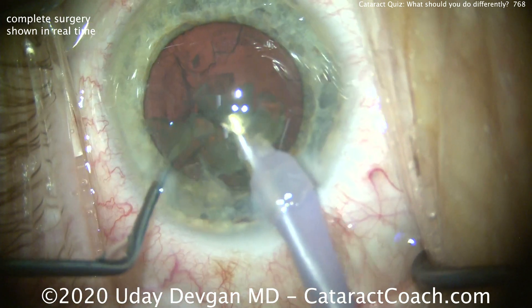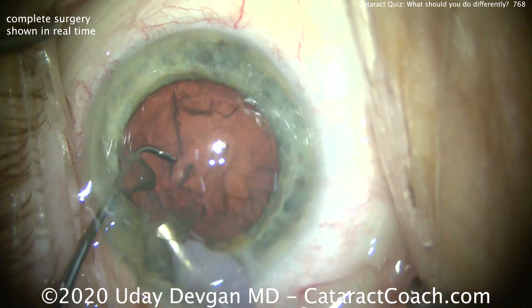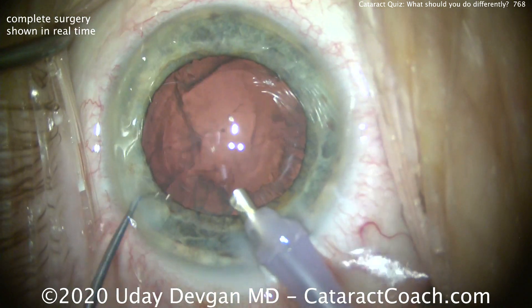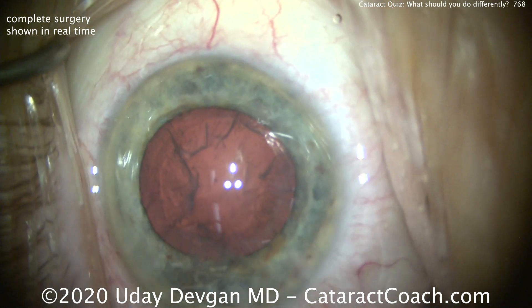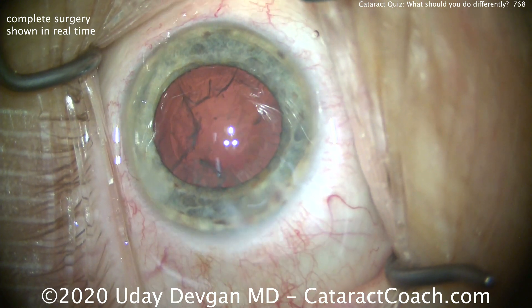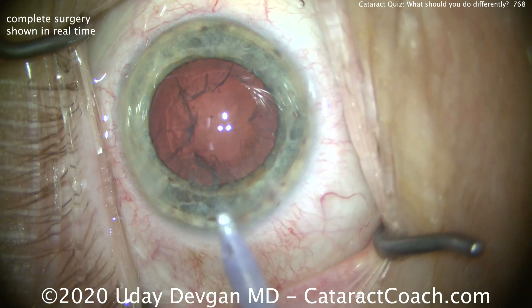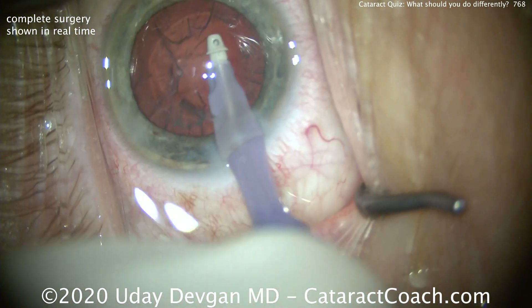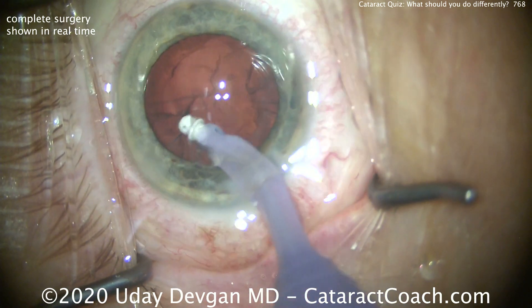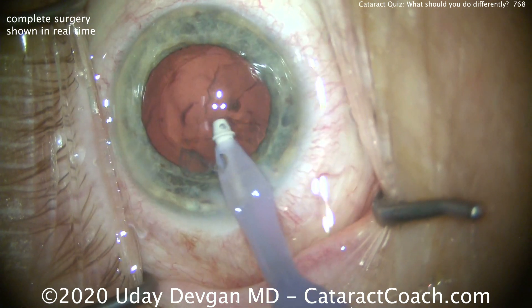We don't want to run hundreds of cc's of balanced salt solution through this eye because that's also going to damage endothelial cells. Staying centrally and removing the rest of the material. The chopper's in that protective position within the capsular bag to make sure the posterior capsule stays away from the phaco tip. In a case like this, you want to avoid at all costs a posterior capsule rupture and vitreous loss, as that leads to even more corneal decompensation. Switching to the I/A probe — flow rates at a low level, 30 to 35 cc's per minute is reasonable. When using phaco power, make sure you're using phaco power modulation: burst mode, pulse mode, a variable duty cycle. There's a whole section on phaco fundamentals on CataractCoach.com to help minimize energy in the eye.